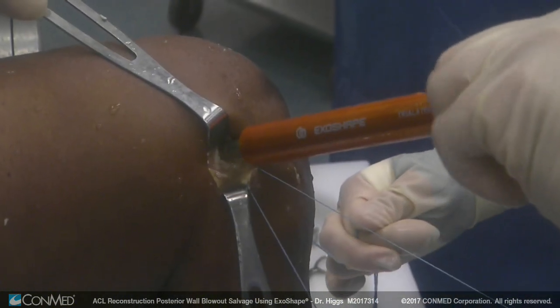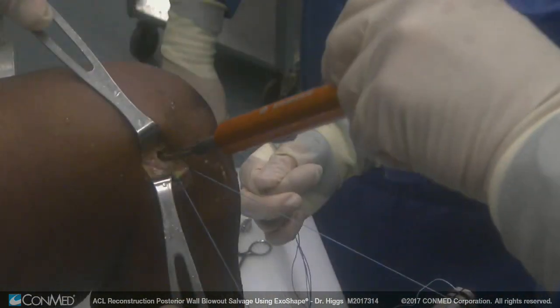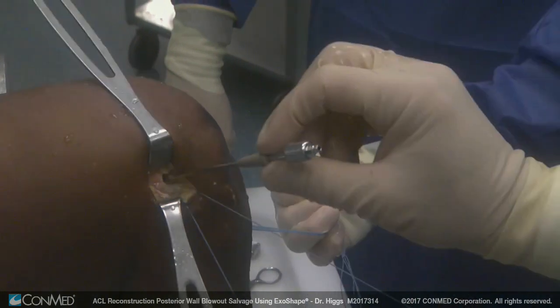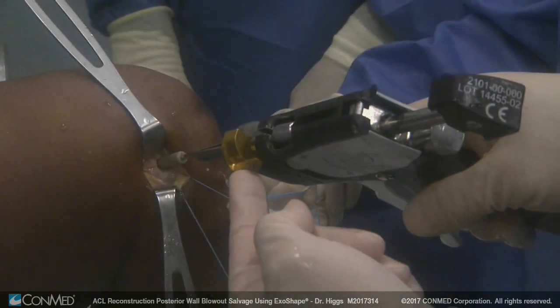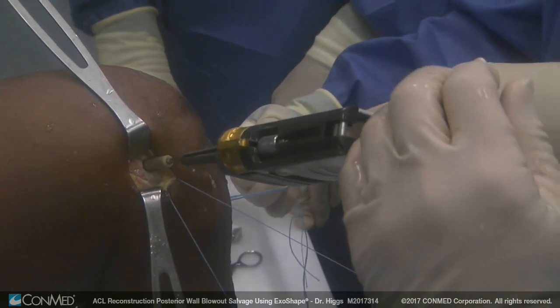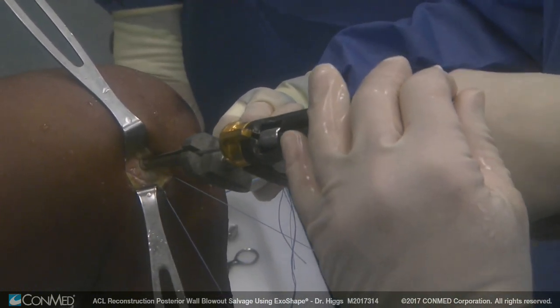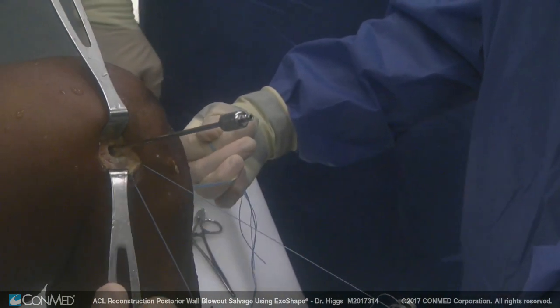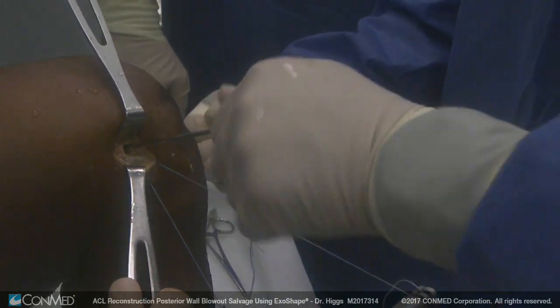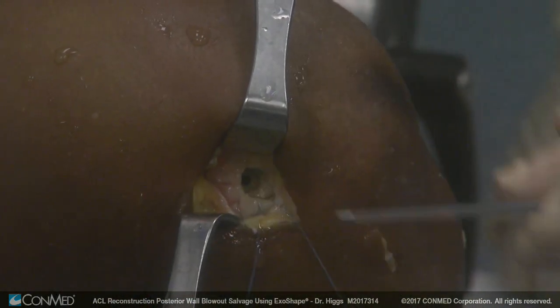Two fingers — I can't twist it. Now when this bullet goes into the implant it'll deploy into a position that compresses the soft tissue against the tunnel wall. I use this gun, lock it down, and simply squeeze the trigger to deploy the bullet into the implant. Then I remove this, and to remove it from the device I simply twist in a counterclockwise direction. You can see the implant down in the femur.